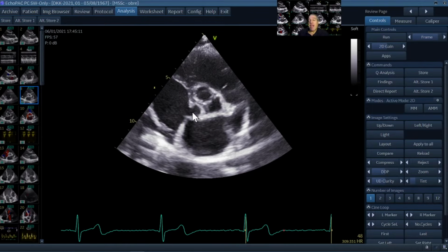So this is the acoronary cusp. No coronary artery, acoronary cusp. Here on the right of the image, you might sometimes see the left main stem. And if this is the right coronary cusp, then this is the left coronary cusp. So we can clearly identify right coronary cusp, left coronary cusp, acoronary cusp.